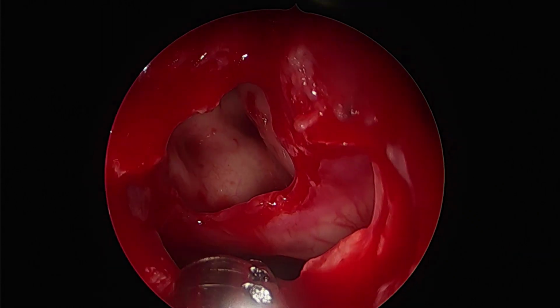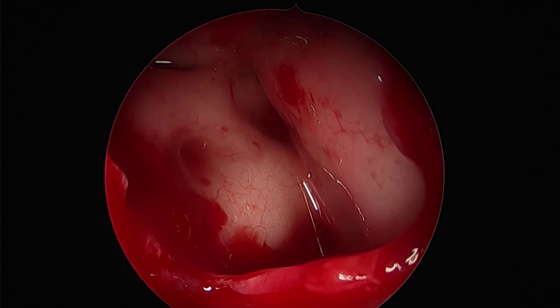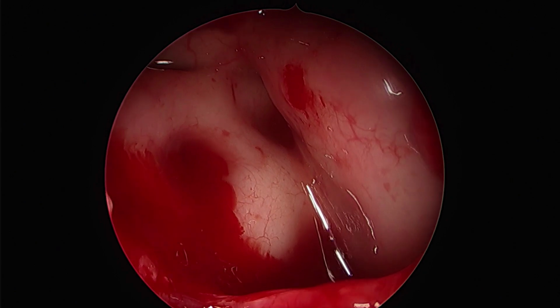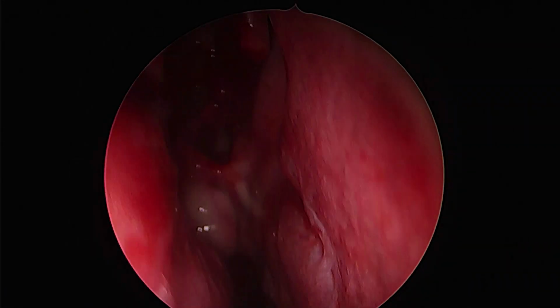While now one can appreciate very easily the sphenoid ostium and the straight septation that separates the Onodi above with the sphenoid, we can see already the landmarks for the optic nerve and the optico-carotid recess in the Onodi rather than the sphenoid in this case.